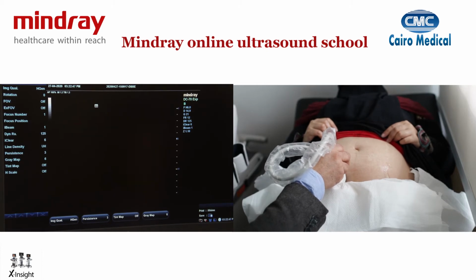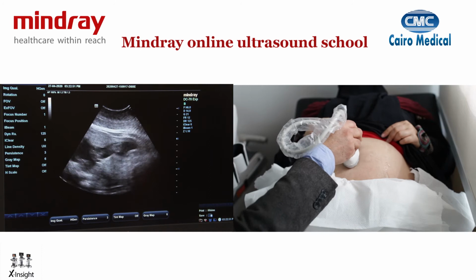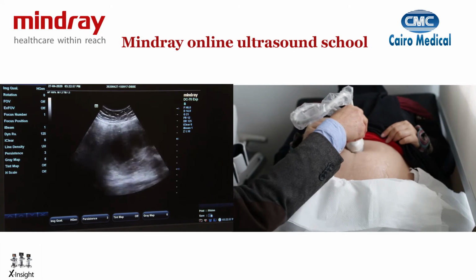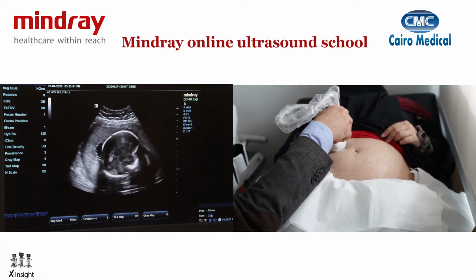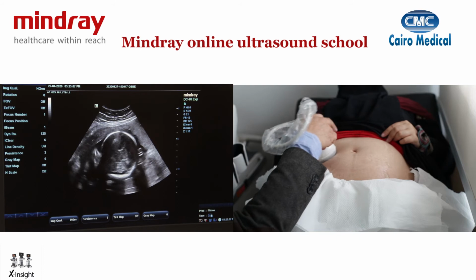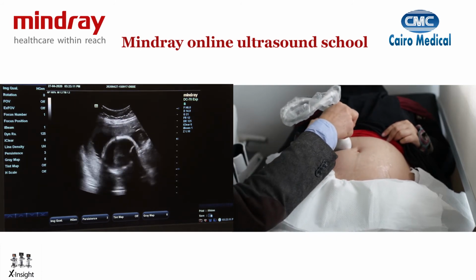The next step for us would be to actually get a fetal biometry survey. So the best starting point from my perspective is always to find the baby's head. So I'm going to move the probe across the patient's abdomen until I find the baby's head, and at that point, when I find the midline echo of the fetal brain, I always move my probe at a 90 degrees angle to try and get a view where I can get the biparietal diameter and head circumference.